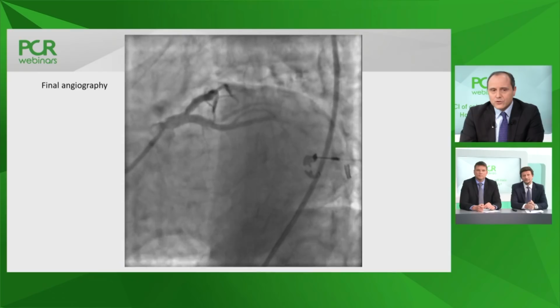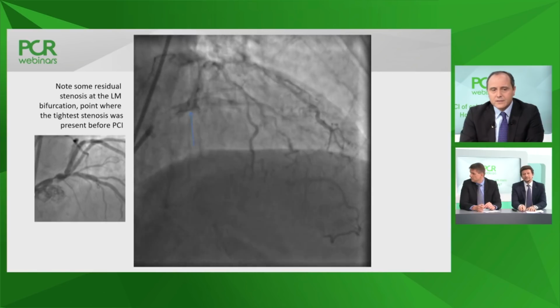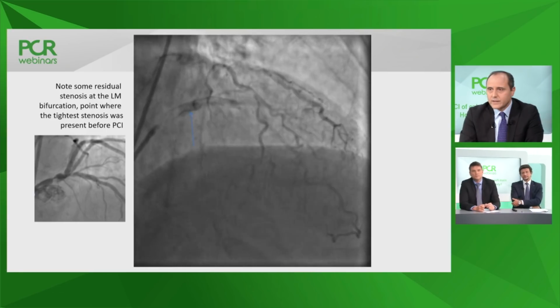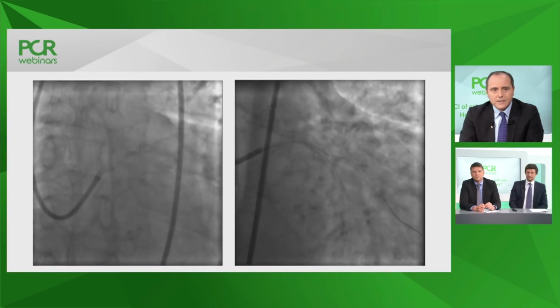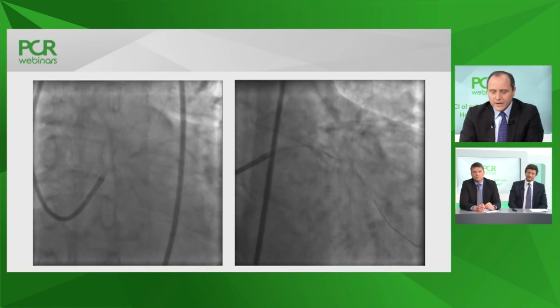This is the final angiography that we see in the caudal view. This is the initial still frame, how it was at the beginning, how it is at the end in this cranial view. And this is how it looks like in the RAO caudal view before and after.